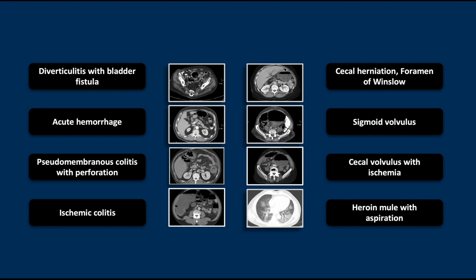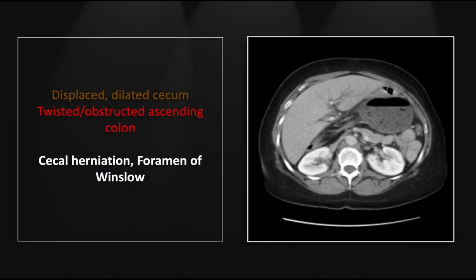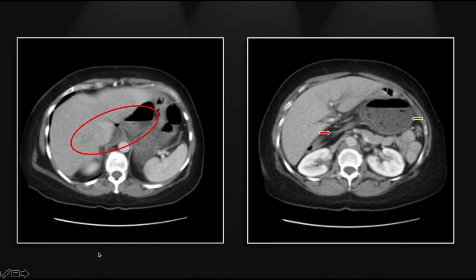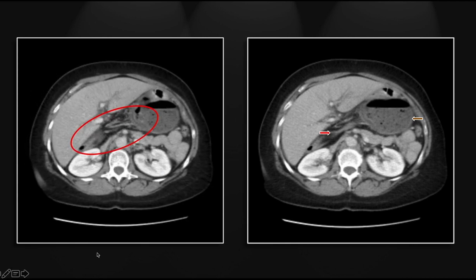Our next case is an unusual cecal herniation through the foramen of Winslow. Here is the tip of the cecum, which has migrated superiorly and from right to left, passing through the foramen of Winslow. You can see it is elongated and distorted throughout this segment, right through the portal region.